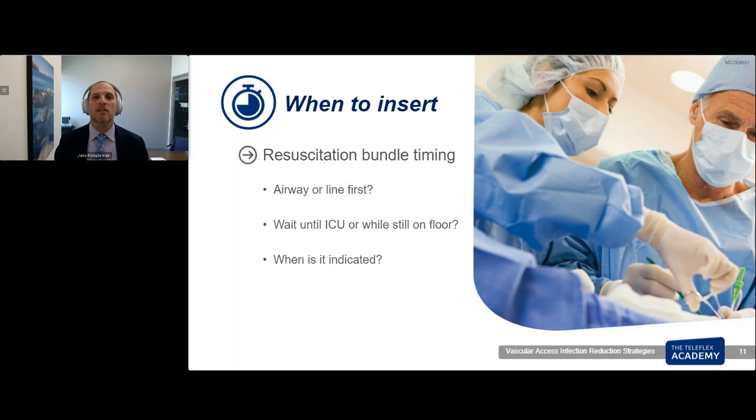And it doesn't mean that you will take the time to appropriately place a central venous catheter. Remember, you need to place a central venous catheter following very strict sterile precautions. You want to have plenty of room to have your ultrasound guidance. You need to have an assistant in the room. And we know that during a resuscitation, that is not always available.